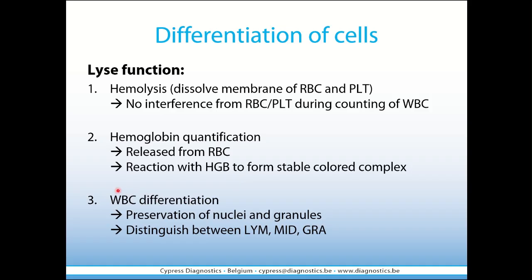And then thirdly, it allows white blood cell differentiation. Only nuclei and granules are preserved, and now the device can distinguish between lymphocytes, mid-sized cells, and granulocytes, the three diffs.